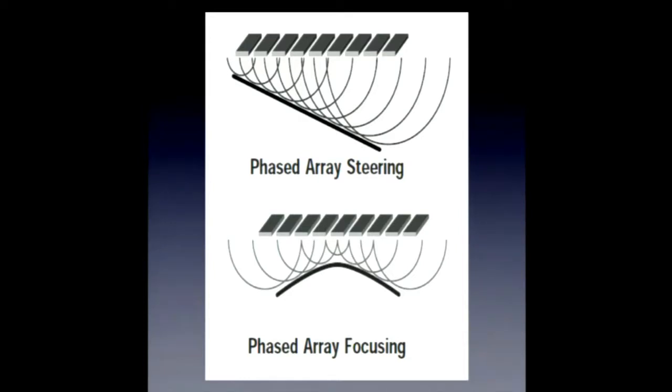So that's called phased array steering. And then the bottom is focusing, which we use for, I think, all kinds of ultrasound imaging. What we're going to do is trigger the outer piezoelectric elements first, so they'll have a head start, and those wave fronts will move out from the outsides, and then we'll trigger the insides later. And so that's how we get a wave front that's sort of converging on each other towards the focal point. And in fact, if we change the timing, we can change where the focal point is, whether it's in the near field or further in the far field.